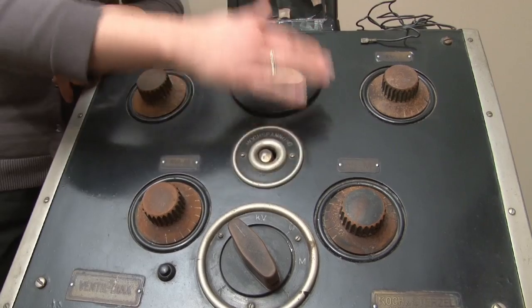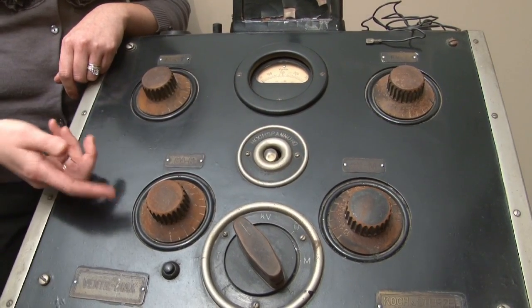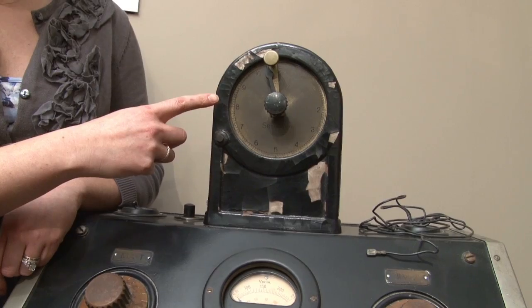This black box controls the kilovolts and amps. The top has a timer that goes up to 10 seconds. These adjustments were made manually for each x-ray.